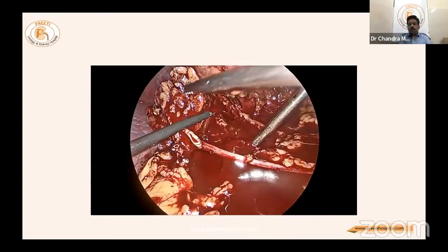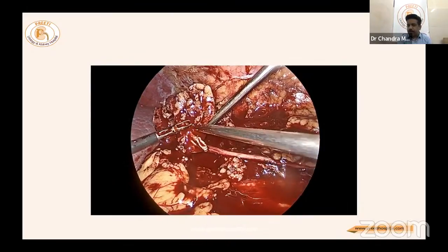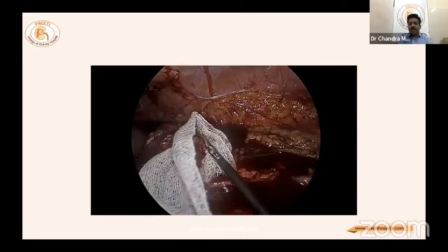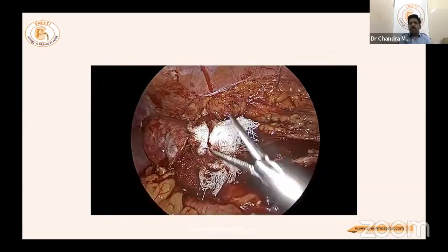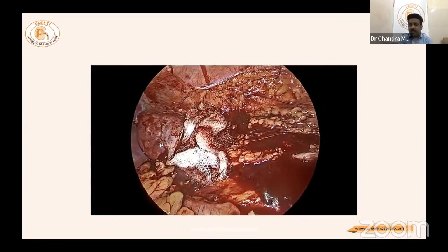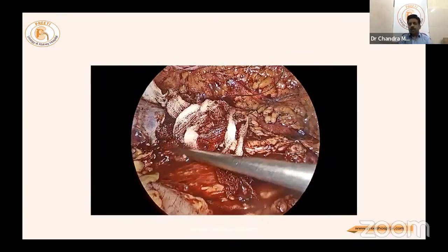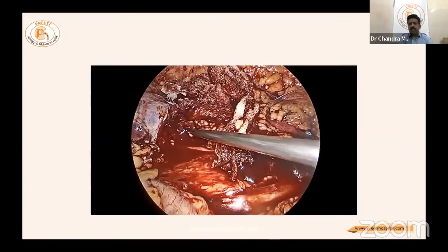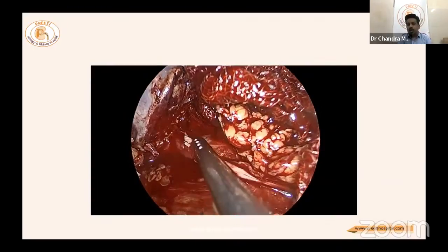After clipping, warm ischemia time is complete. Around 20 to 30 ml of blood loss will be expected — no cause for concern. There will be inner hemorrhage but not outer. Waiting five to ten minutes without obvious bleeding helps. If bleeding continues, advanced suturing skills are required to take superficial bites only, not deep.